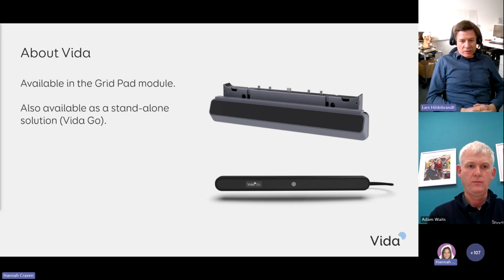Here we have a picture of the Vida and Vida Go, and it's available as a GridPad module for the 13 and later on for the 16 as well. But also there are adapters for older GridPads, 12 and 15, where you can mount the Vida Go. Next slide.